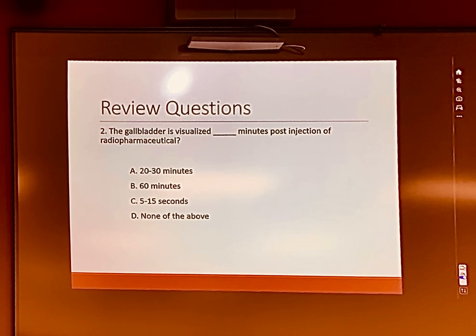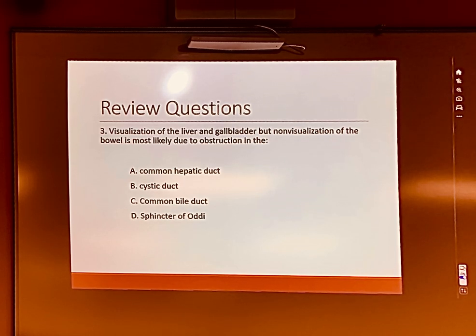The gallbladder is visualized in how many minutes post-injection of the radiopharmaceutical? 20-30 minutes. Yep. Visualization of the liver and gallbladder, but non-visualization of the bowel is most likely due to the obstruction of the what? CBD.